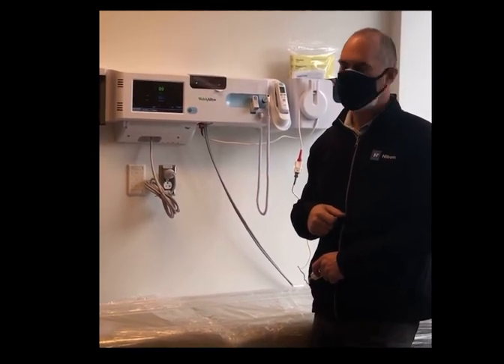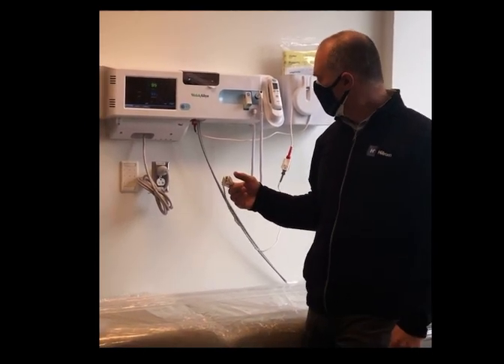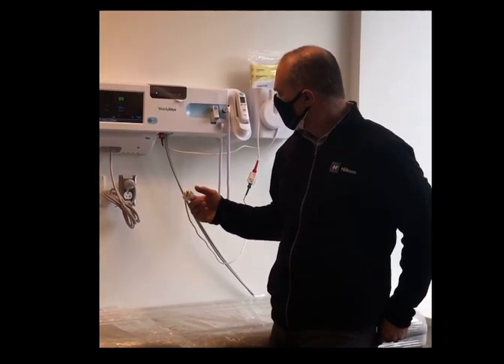15 seconds, okay — give it a little bit. I'm going to put it back on, though, because I want to show you that many times our customers get confused sometimes.